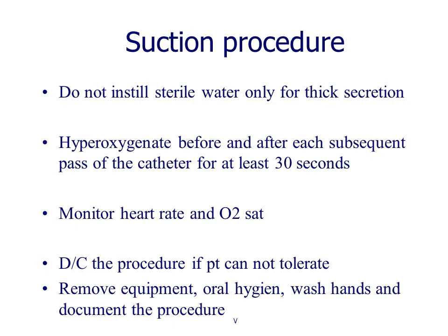Hyperoxygenate before and after each subsequent pass of the catheter for at least 30 seconds, using the ambu bag, which could be connected with an O2 source.